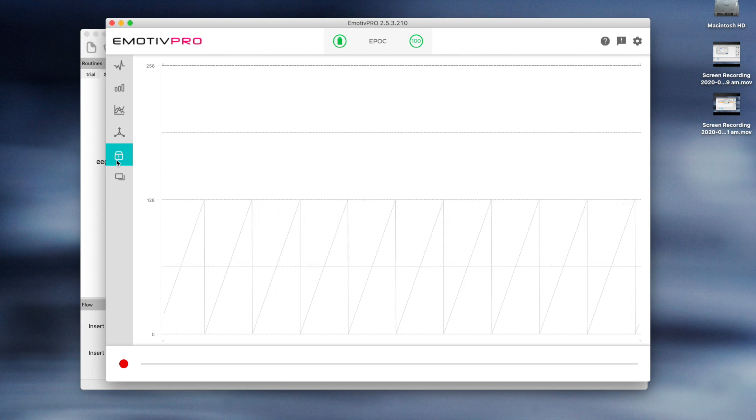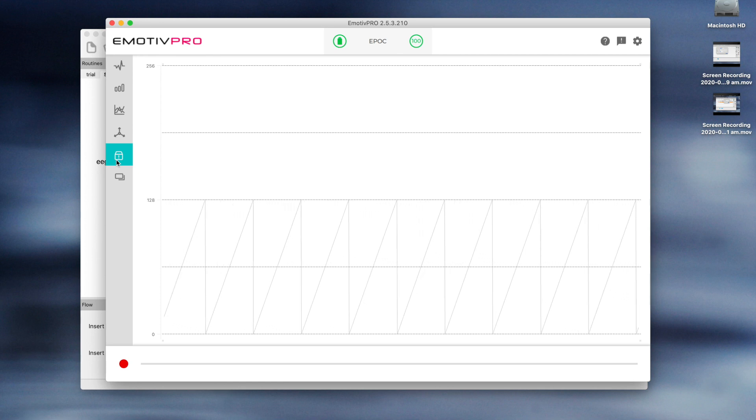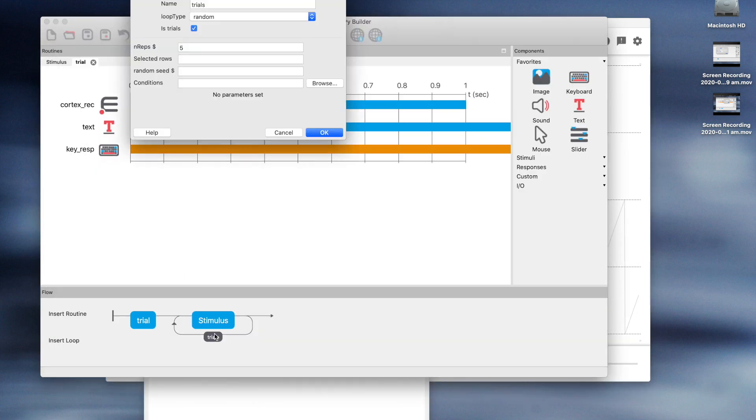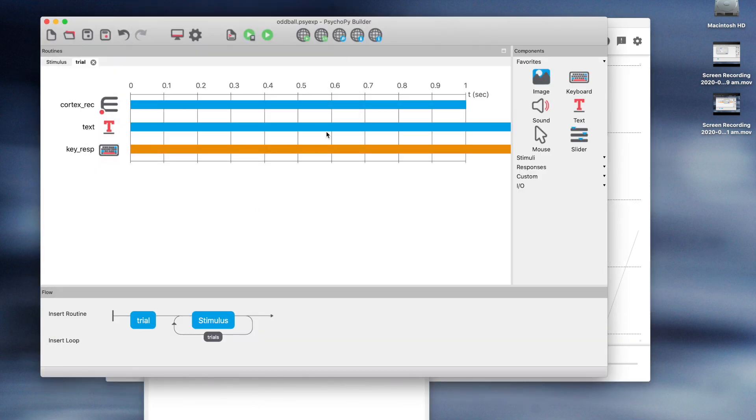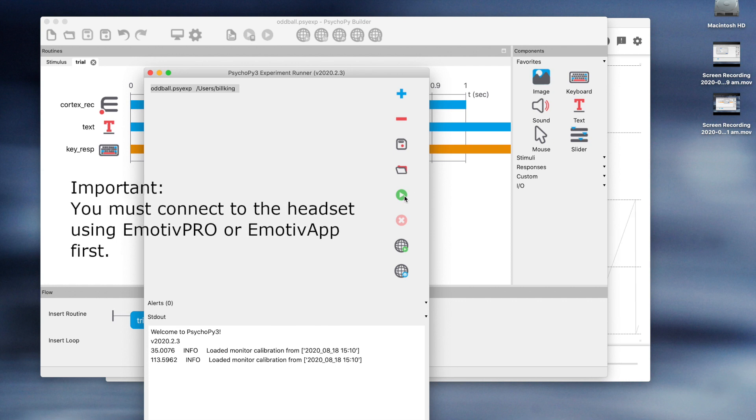It looks like the connection is working well here, so let's go back to PsychoPy and run the experiment. Let's set the number of repetitions. The more the better, but for this demonstration, let's try 300 which will give us about 60 oddball trials. Now let's run the experiment.